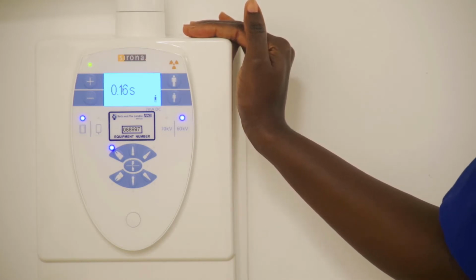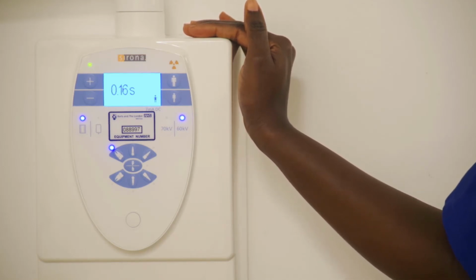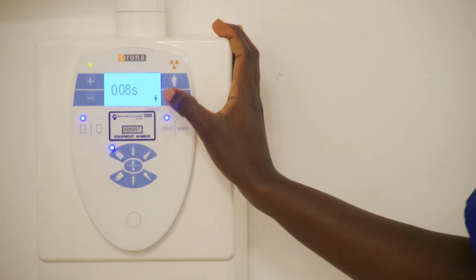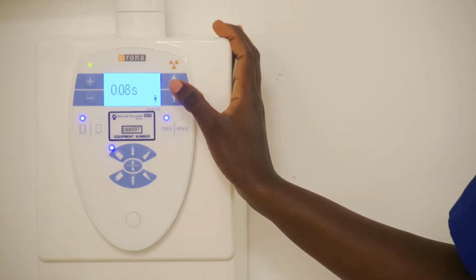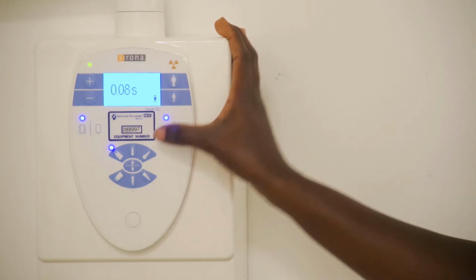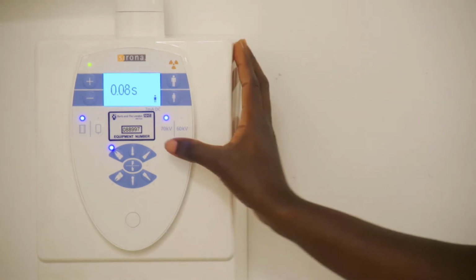The low energy photons will be deposited in the skin, increasing the dose to the patient. At 70, the photons have high energy, so nothing is deposited in the skin, and it reduces the dose to the patient. So please ensure that you are clicking on 70.